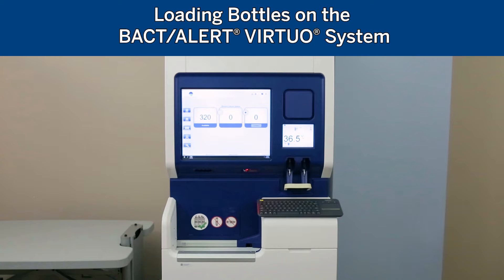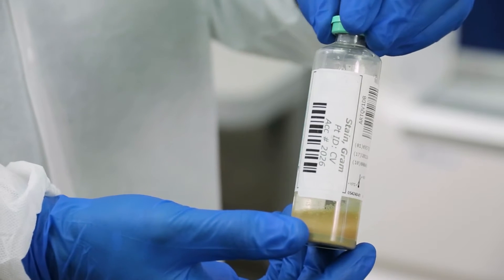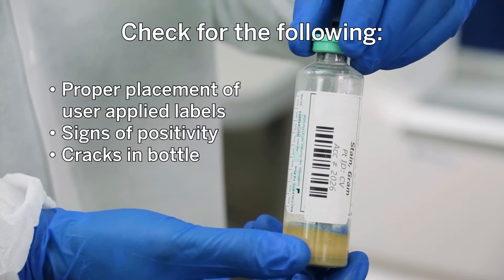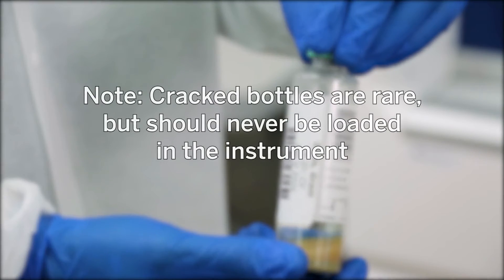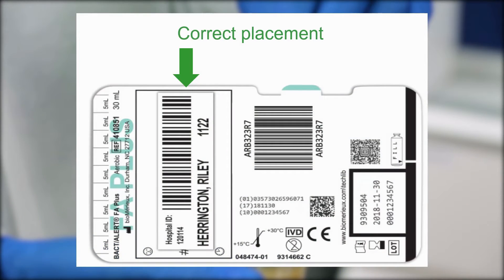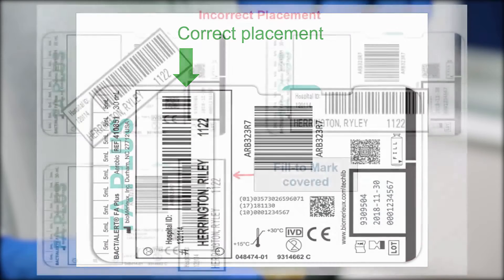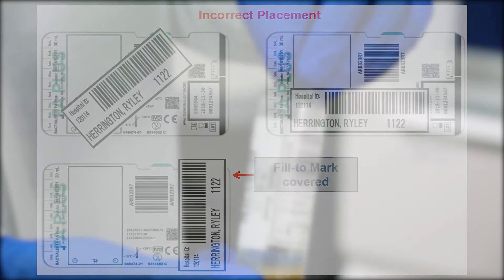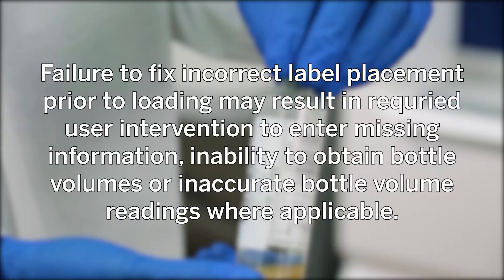Loading Bottles on the BactiAlert Virtuo system. First, inspect bottles before loading and check for the following: proper placement of user-applied labels, signs of positivity, and cracks in the bottle. Cracked bottles are rare but should never be loaded into the instrument. User-applied barcode labels should be placed vertically within the designated area so that the orientation is the same as the bottle barcode. If user-applied labels have been placed incorrectly, the user may attempt to fix them before placing bottles on the instrument. Note: failure to fix incorrect label placement prior to loading may result in required user intervention to enter missing information, inability to obtain bottle volumes, or inaccurate bottle volume readings where applicable.